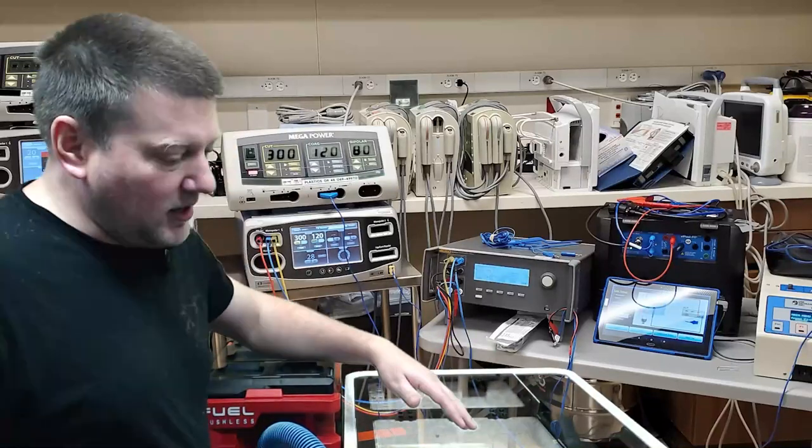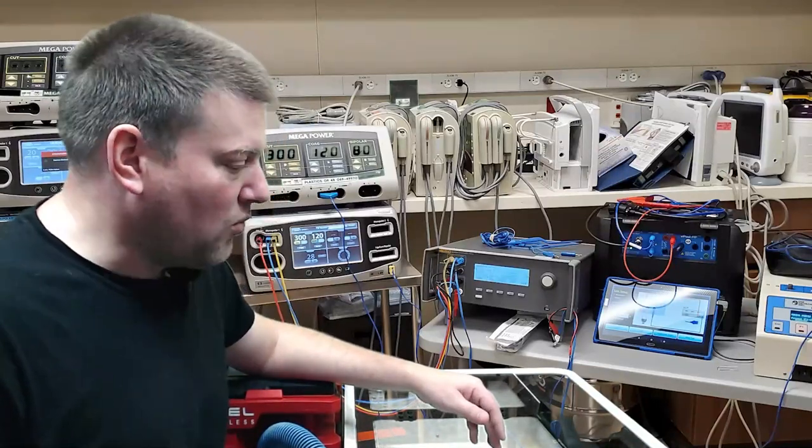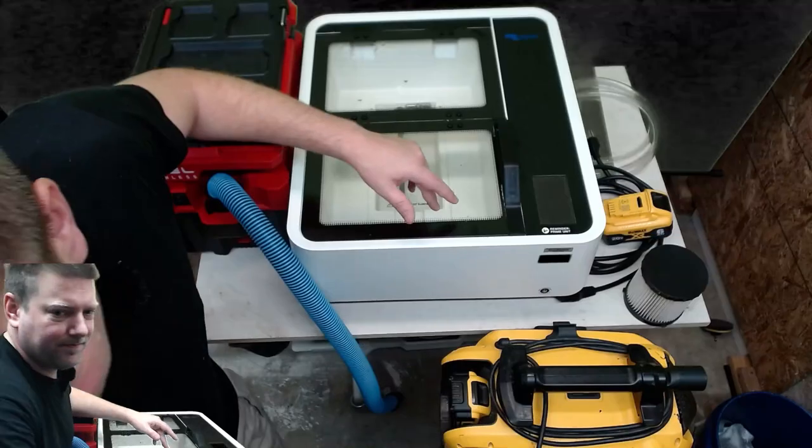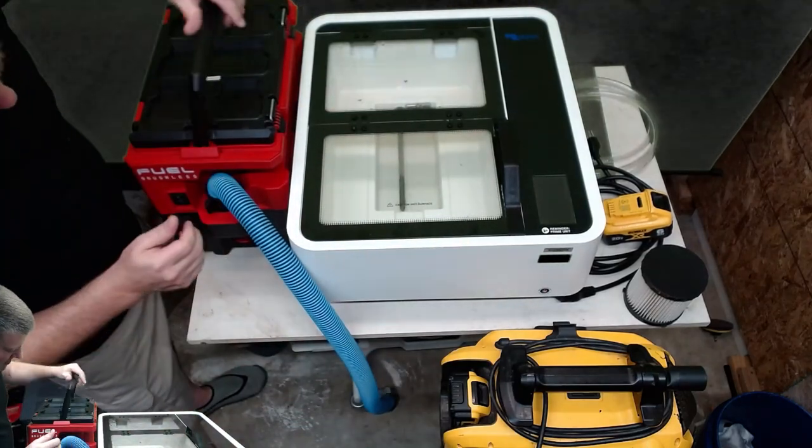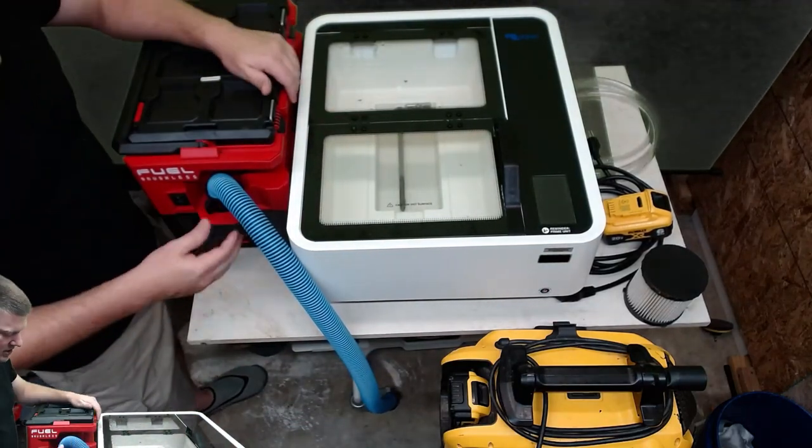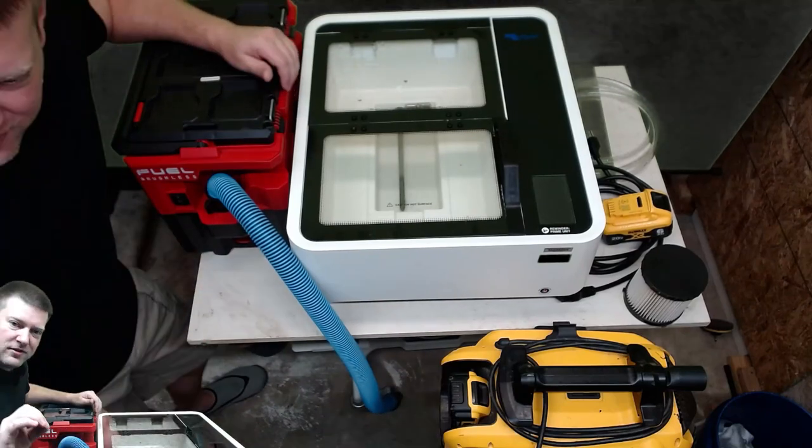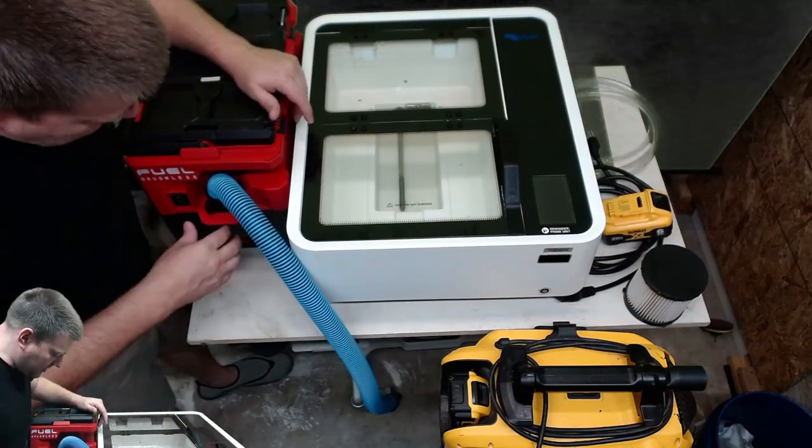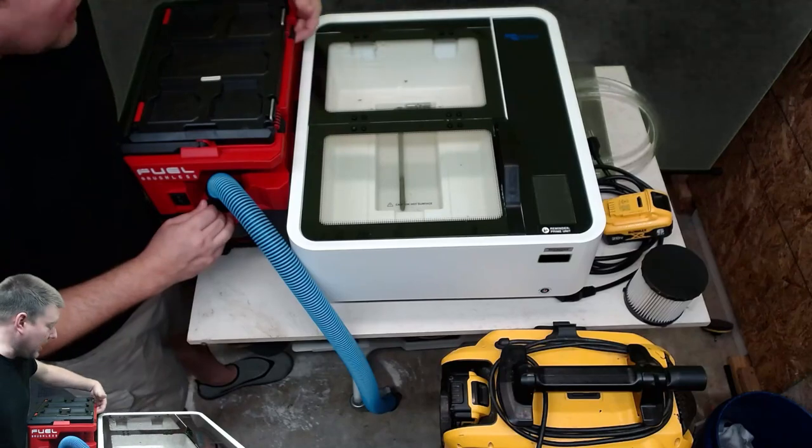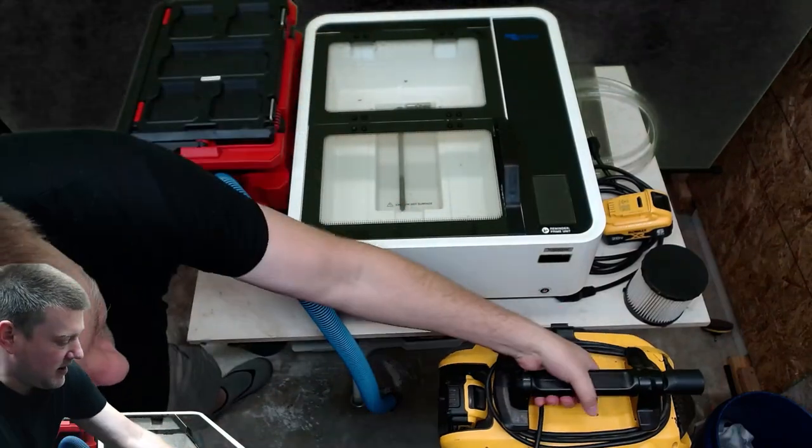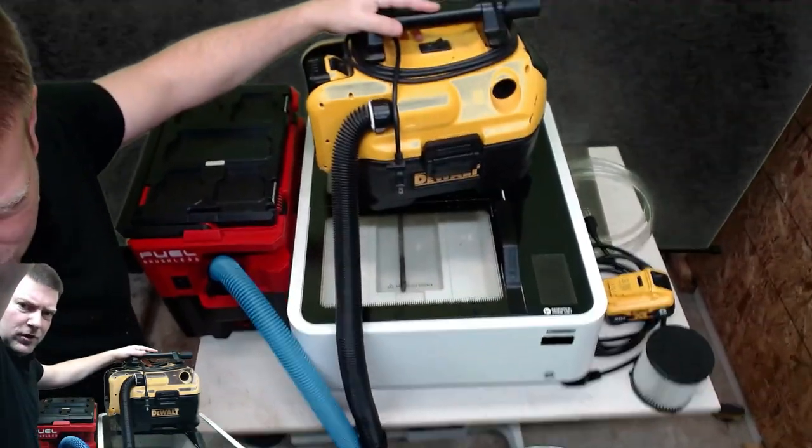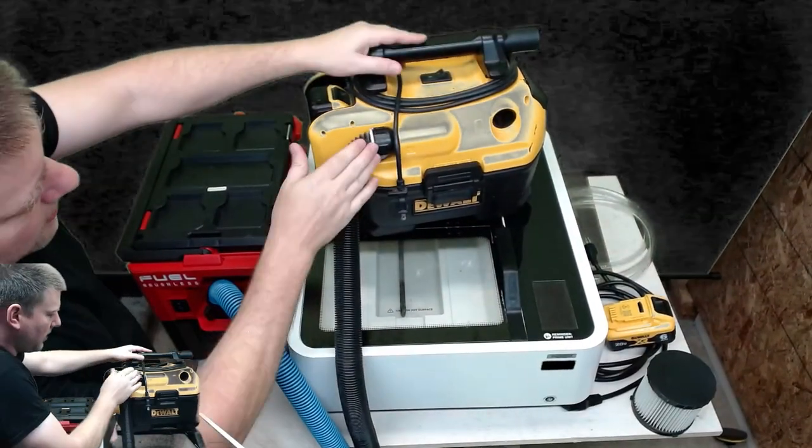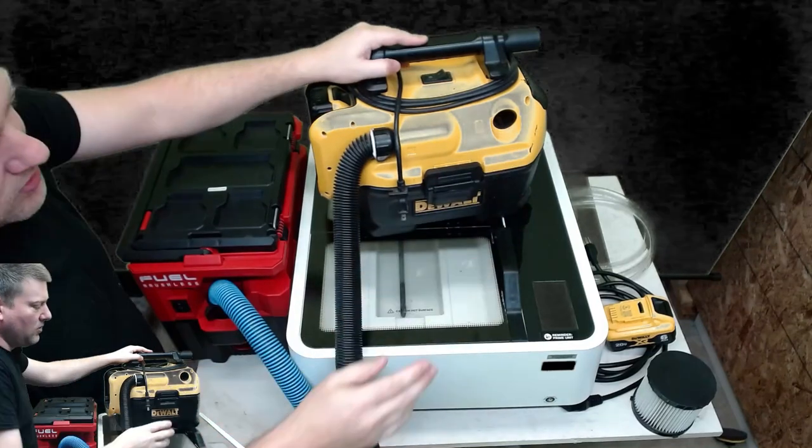Let's first go over what vacuums I have. This here is the Milwaukee packout version. All these vacuums have two things in common: they have a suction port and an exhaust port. Here I have the DeWalt version with a suction port and evacuation port.